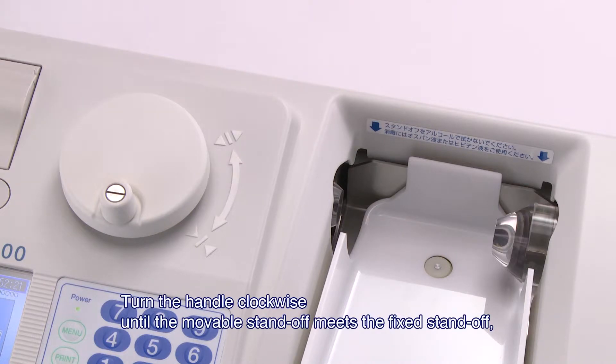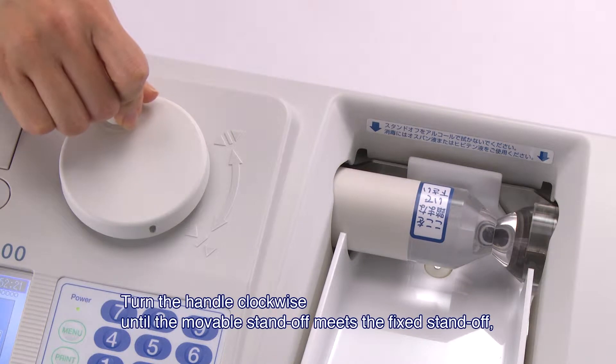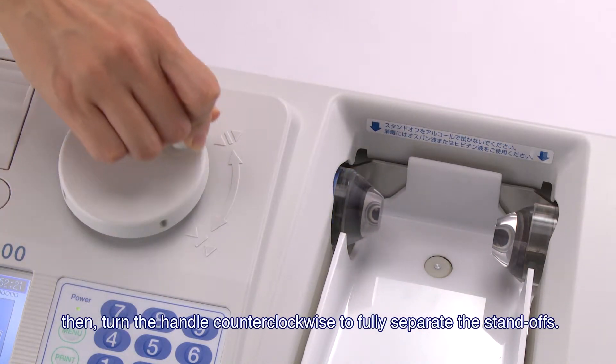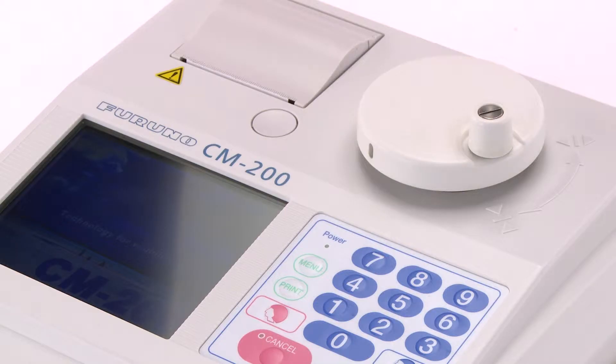Turn the handle clockwise until the movable standoff meets the fixed standoff. Then, turn the handle counterclockwise to fully separate the standoffs. This completes the initialization process.